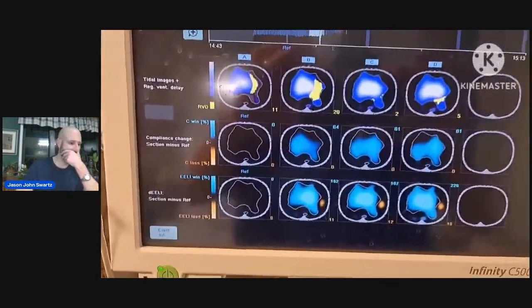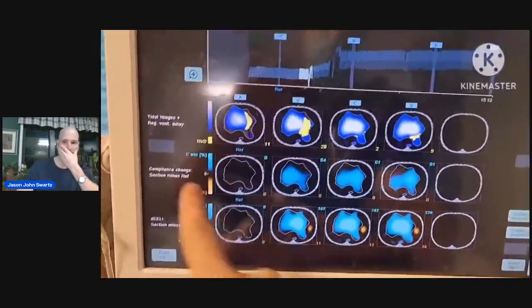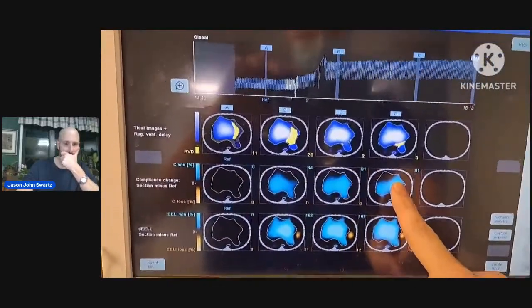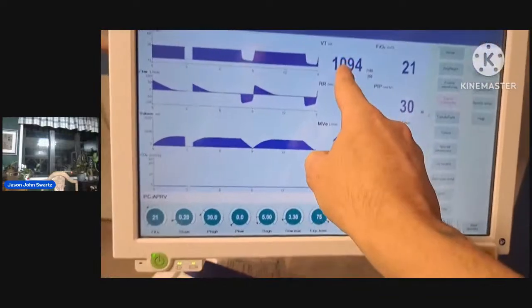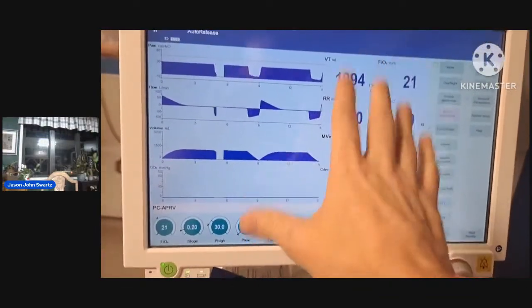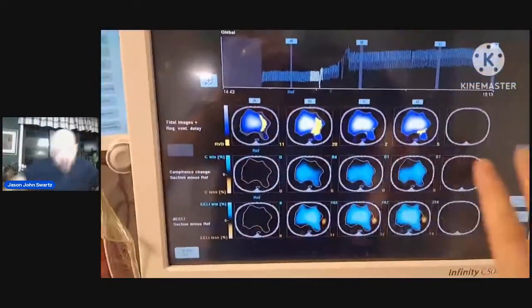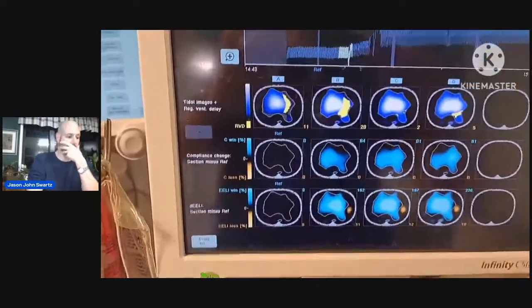And then over here, it's showing compliance win, compliance loss. We only have compliance wins, okay? Zero compliance loss. With that, understand that this isn't just blindly allowing this release. Everything is being evaluated. Everything is optimal here.